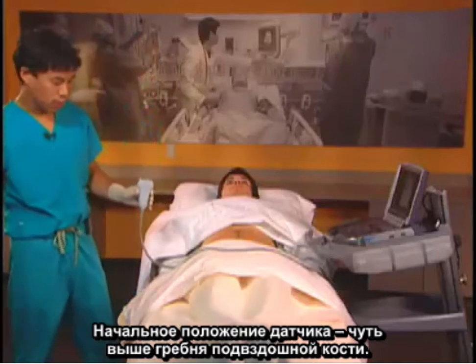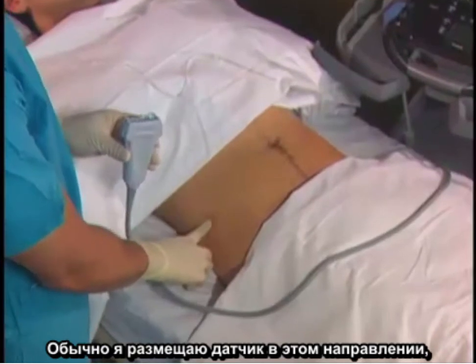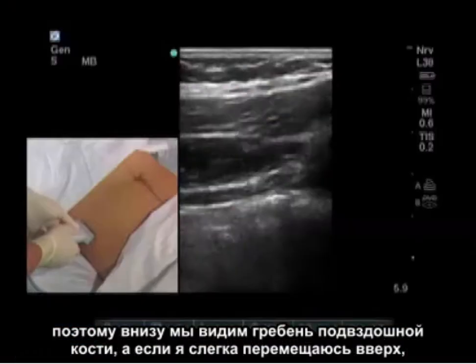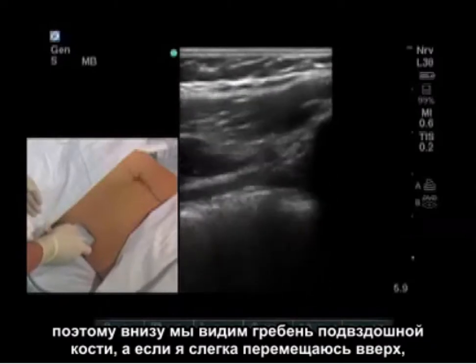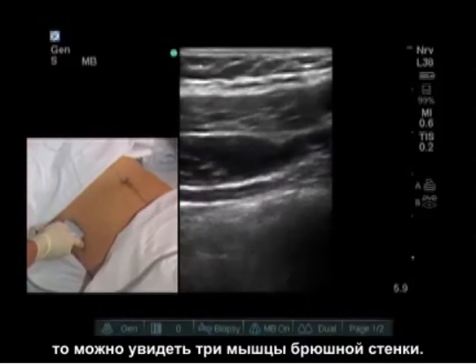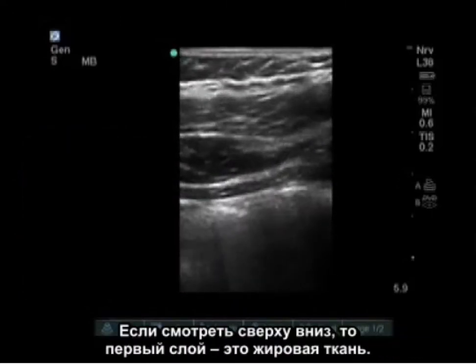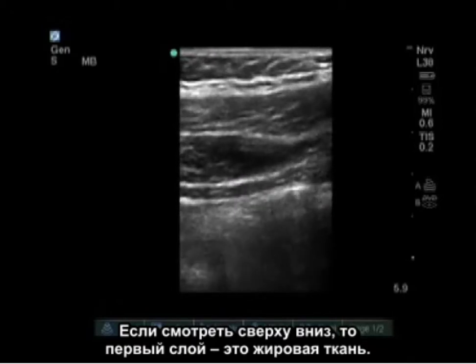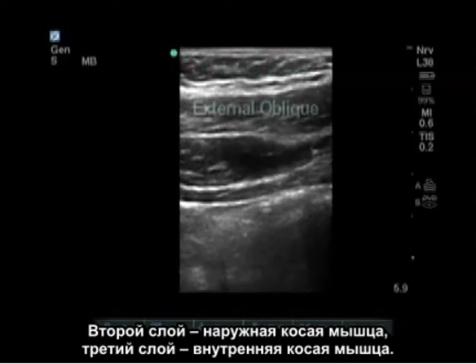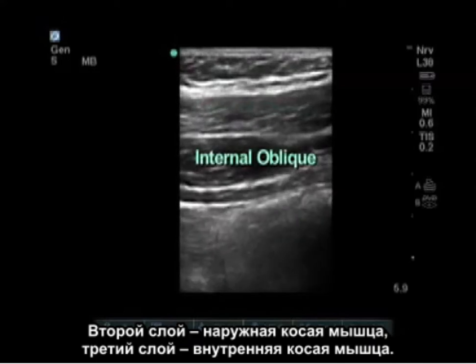Our initial probe placement is going to be just above the iliac crest. I usually place the probe in this direction so we can see both the iliac crest caudally and, if I move slightly cranially, you can see the three muscles of the abdominal wall. Going from superior to inferior: the first layer is adipose tissue, the second layer is external oblique, and the third layer is the internal oblique.